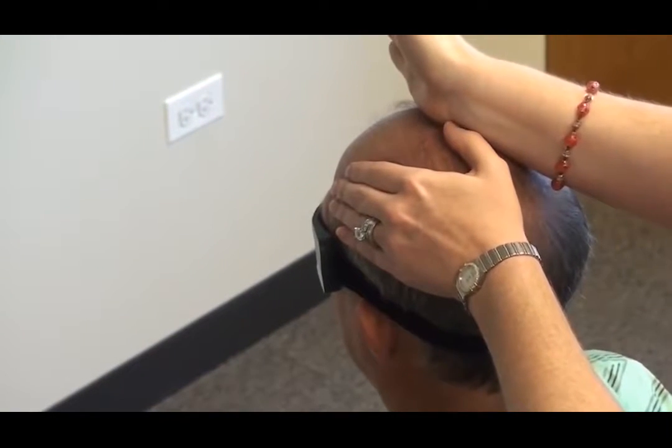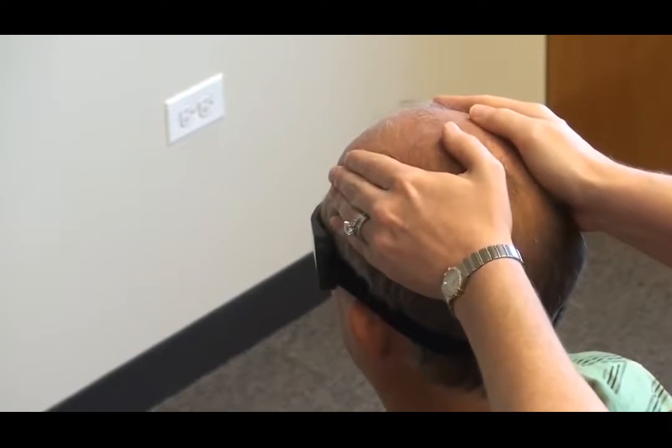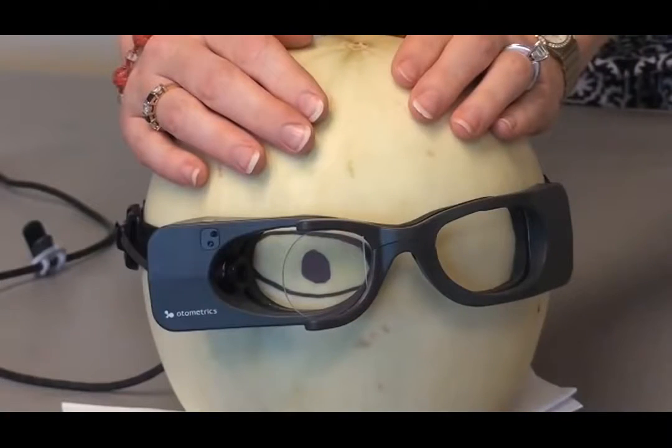But also notice that as we move from here to here, it is a fast movement, 150 to 200 degrees per second. If you have never done head impulses before, you're going to need to practice. It is best not to practice on the patient. This looks a little odd, but you can be creative.